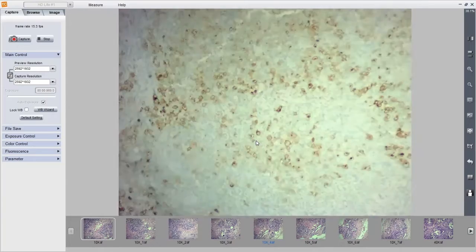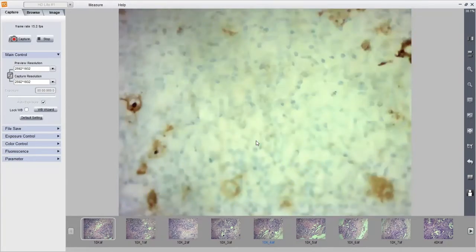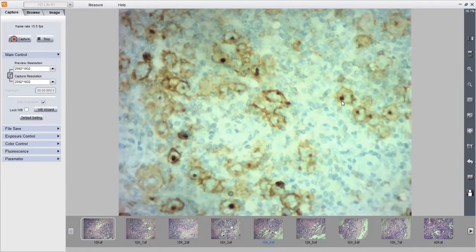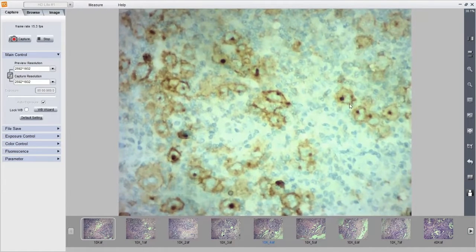Okay, I will show you the Golgi-like staining a little bit more in high power. All of this I was showing you in scanner view. I'm emphasizing that scanner view is the most important magnification for a diagnosis of lymphoma. This is a Golgi-like staining out here. Beautiful.